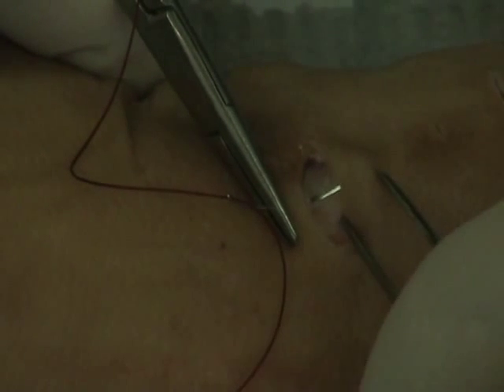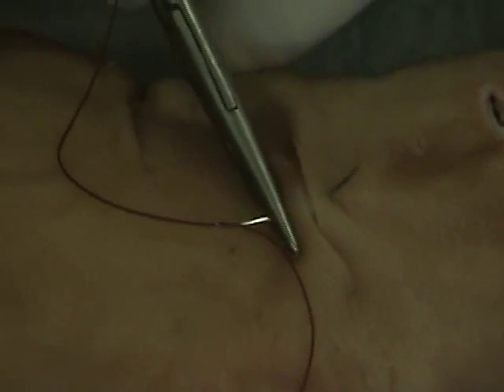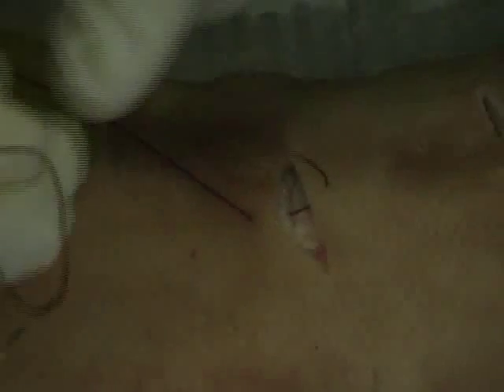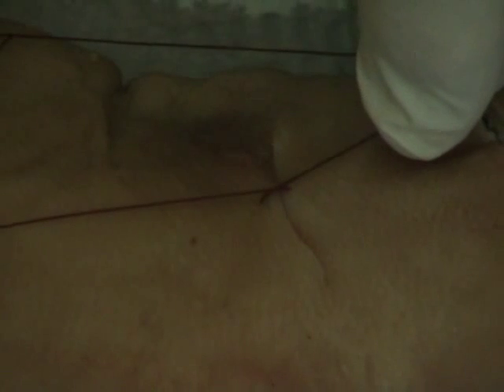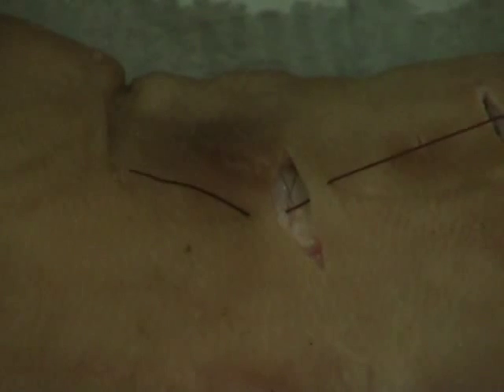Notice I can kind of play with this a little bit, pop this through. Okay, see how this is going to close out. I think this is going to close out pretty well here. So pull through, close it up again, and that's going to close up real nice. Okay, so the first stitch. But you're noticing I'm playing with my actual positioning on one side versus the other to make sure that this first stitch is going to hold up real well.